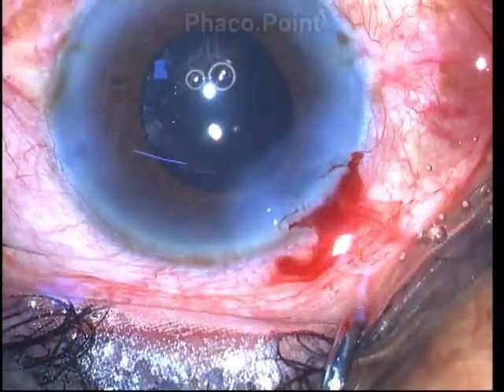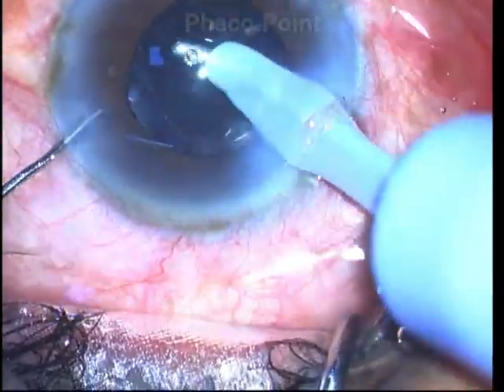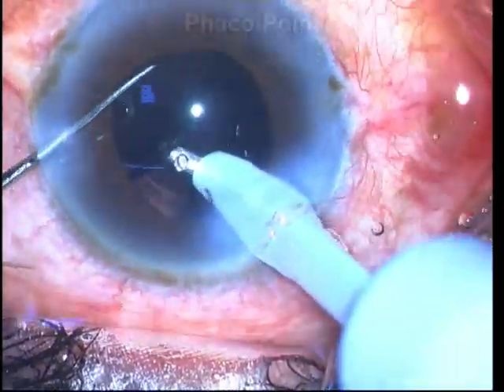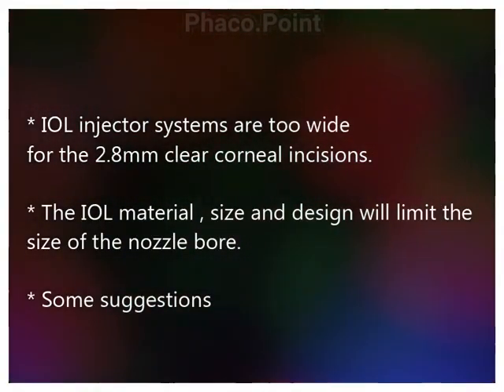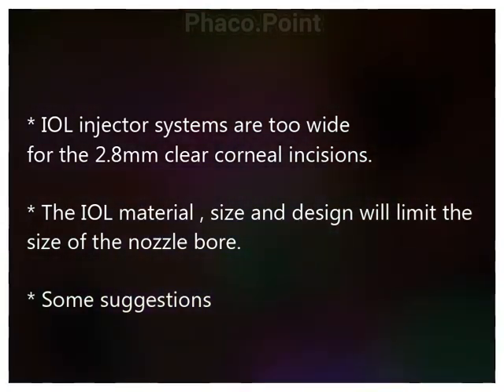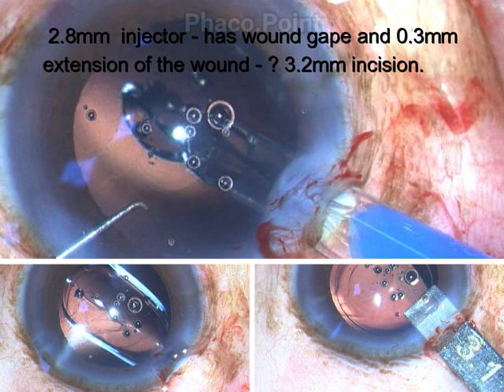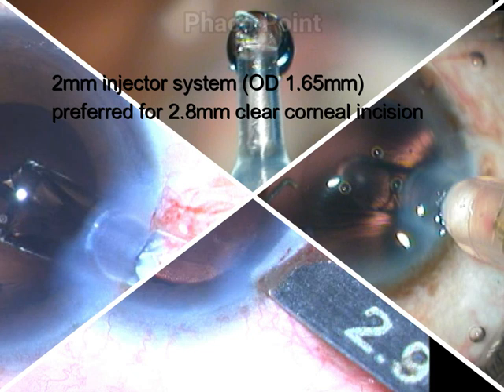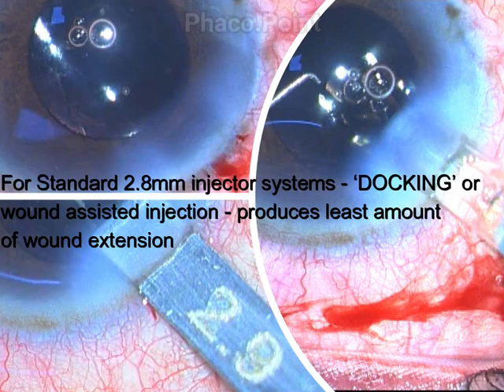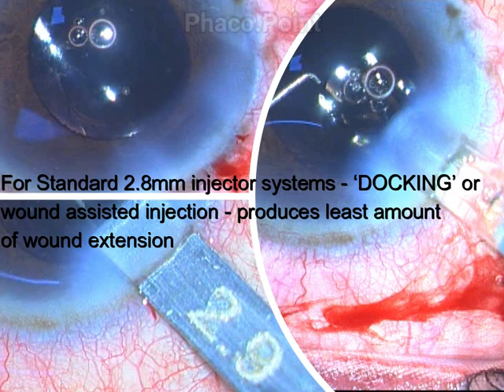All you have to do is keep the tip of the nozzle — which measures about 2.65 mm — at the lip of the clear corneal incision and then inject the lens in a careful and controlled manner. There is not much distortion of the main incision and no back-leak of fluid. To sum up: unless we develop newer IOL materials injectable through tiny bore nozzles, we should either inject hydrophobic IOLs through a 3.2 mm incision with a standard nozzle, or use a 2.8 mm incision with cartridges meant for the 2 mm incision. The wound-assisted or docking method achieves less wound distortion and better post-operative results. Thank you for your attention.